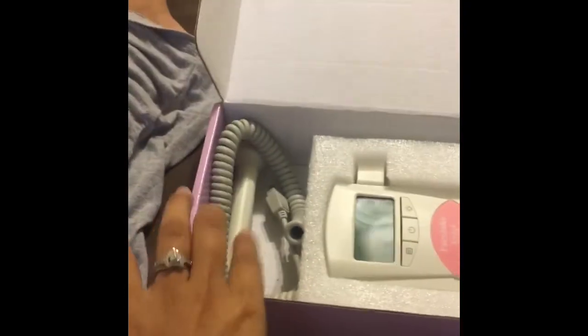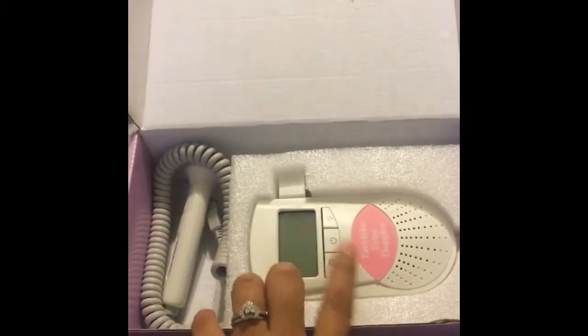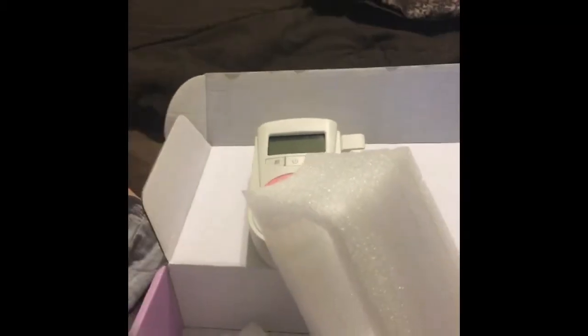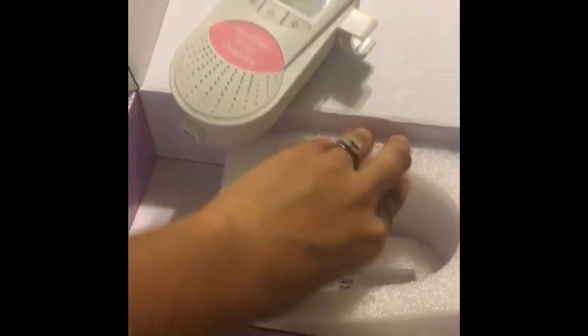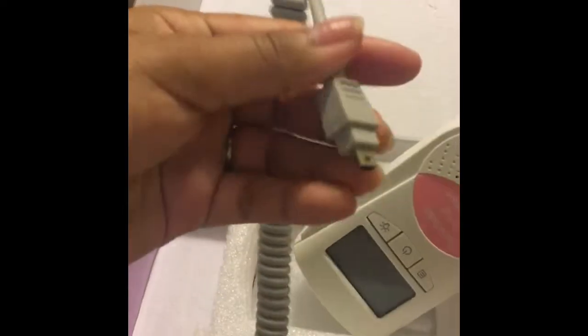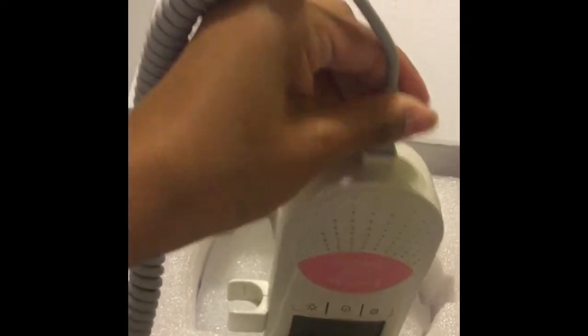You open it and it comes with the little probe and this little connector piece — you take it out. Sorry, I'm using both hands and it's a little difficult. Give me a second to put it together. You just put this little part here — yep, there it goes — and you turn it on.